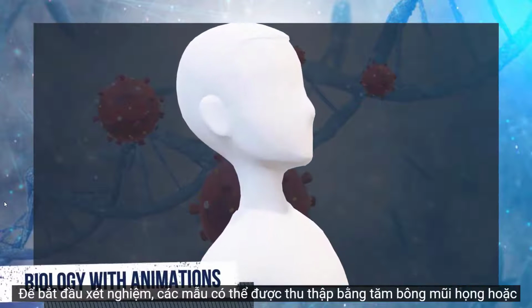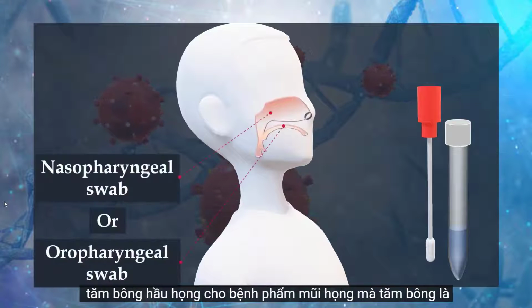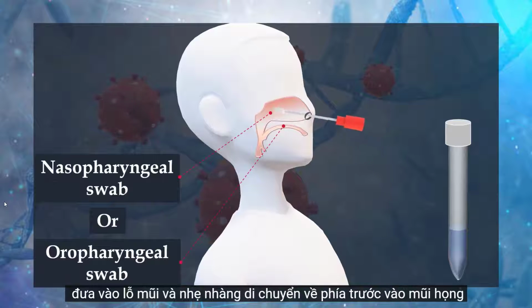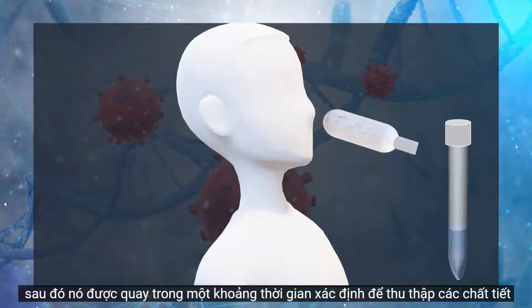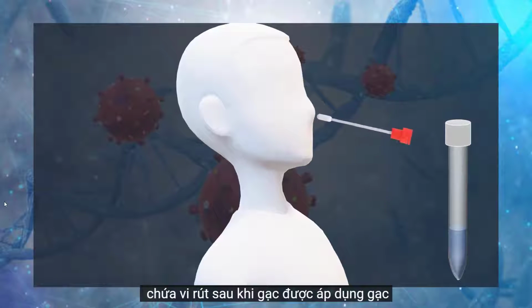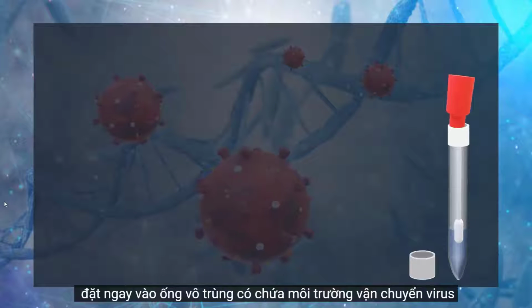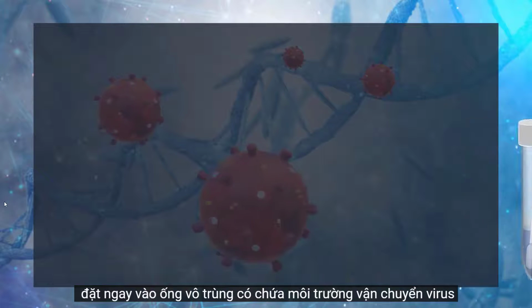To start a test, the samples can be collected by a nasopharyngeal swab or an oropharyngeal swab. For a nasopharyngeal specimen, the swab is inserted in the nostril and gently moved forward into the nasopharynx, then it is rotated for a specified period of time to collect secretions that contain the virus. Once the swabbing is applied, the swab is placed immediately into a sterile tube containing a viral transport medium.